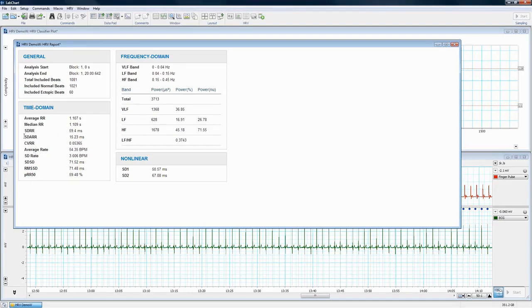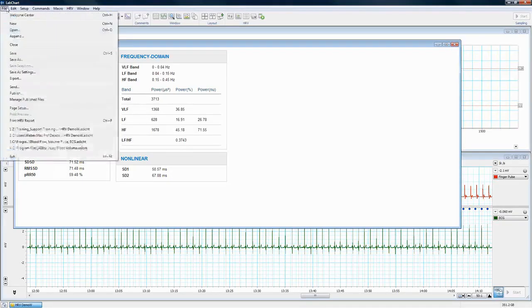So average of the standard deviation of the RR interval, according to the averaging we have it set up here. What are the powers for the different bands? What are their peaks? What's the LF/HF ratio? Pretty common. SD1, SD2 we'll talk about later when we talk about the Poincaré plot. What percentage of the RR intervals are over 50 milliseconds? Right here. So everything we did before. And like I said, we've made some changes here, number one, for ease of use. Number two, just to make things align more with what's current in HRV analysis.